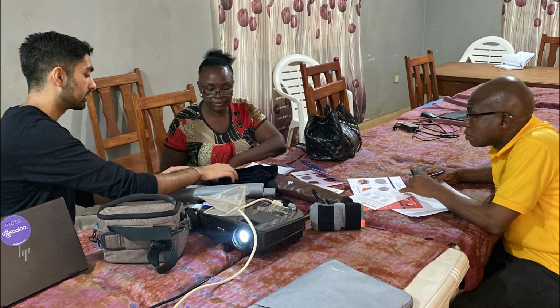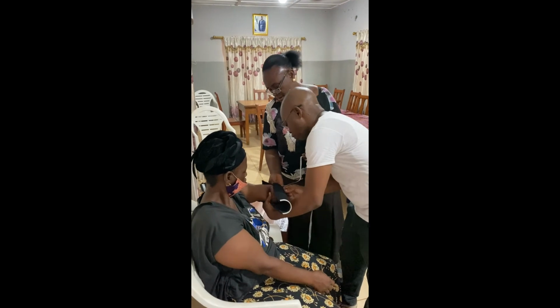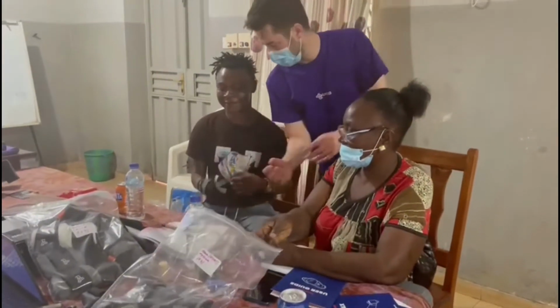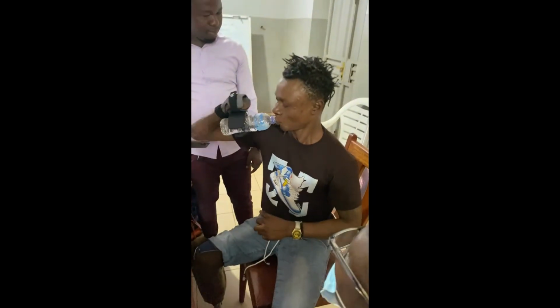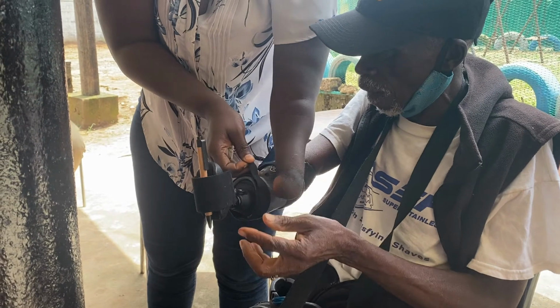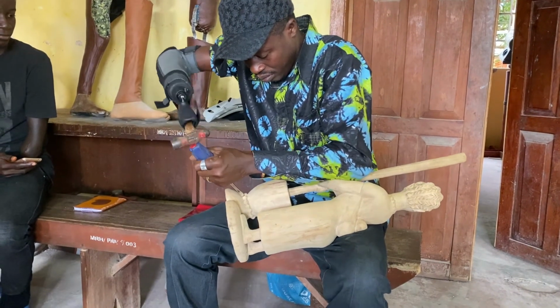That training program, we took 2 people that worked at the National Rehabilitation Centre, a prosthetist and a rehabilitation worker, and we designed a training program for them, a training course, in how to fit all the prostheses, what all the tools do, the cosmetic hand, and what kind of limb body service we offer in the UK and how that might translate to the Sierra Leonean context.